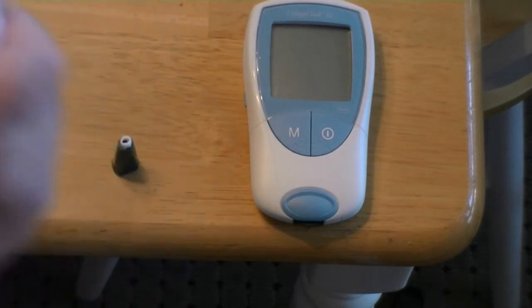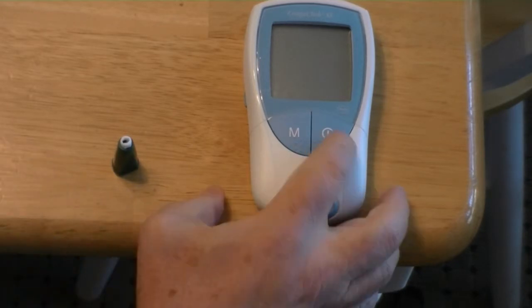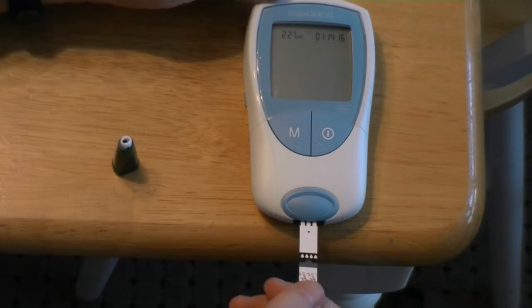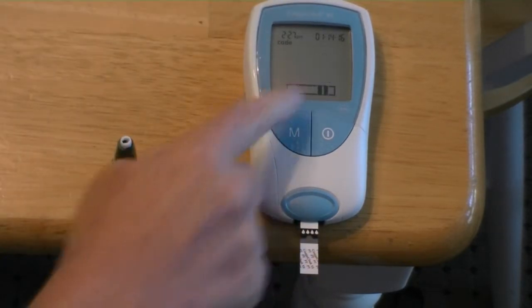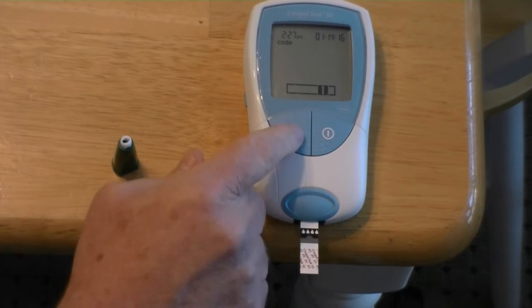You have to check the number on here, which is 109, and that will be the same number that comes up on the meter when we insert the strip, so that we're sure we're using the same strip that the meter is calibrated to. You'll see there's a 109 on the strip and 109 on the meter — so we have a match and we're good to go.